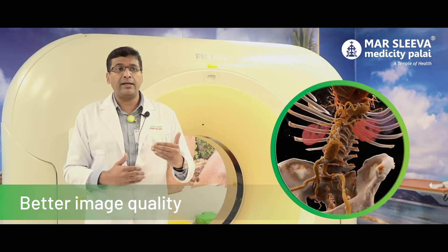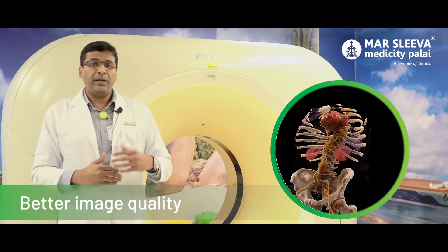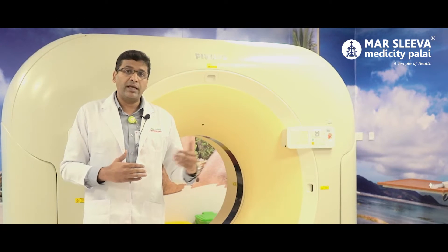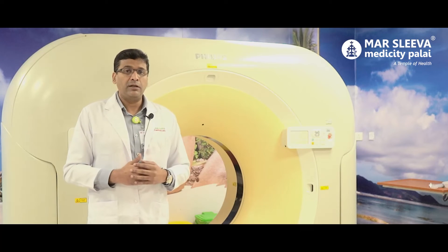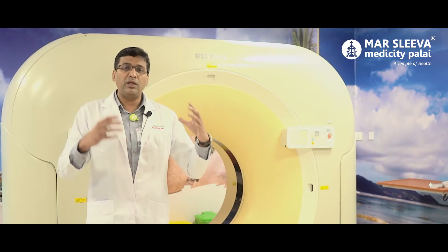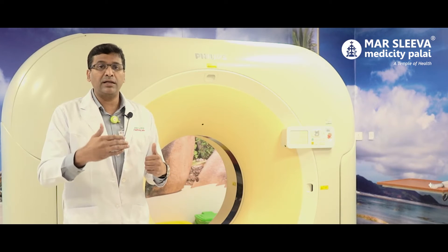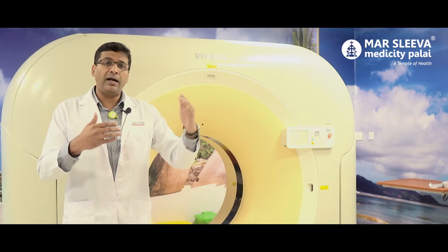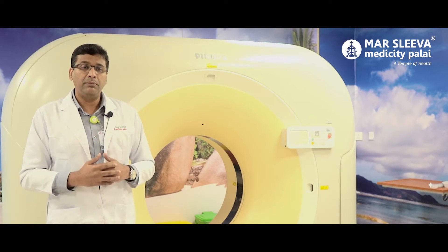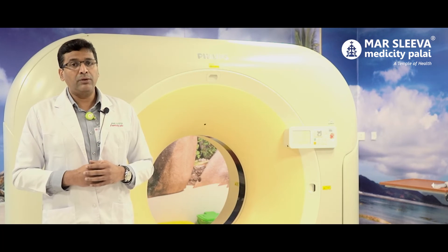With better image quality, radiologists can get a clearer picture and achieve better diagnosis. The 128-slice CT scanner is very fast for CT coronary angiography. The heart and its vessels are captured clearly. With a single rotation during a heartbeat, the heart study is completed. The vessels are clear, the image quality is better, and we can detect defects and abnormalities more accurately.